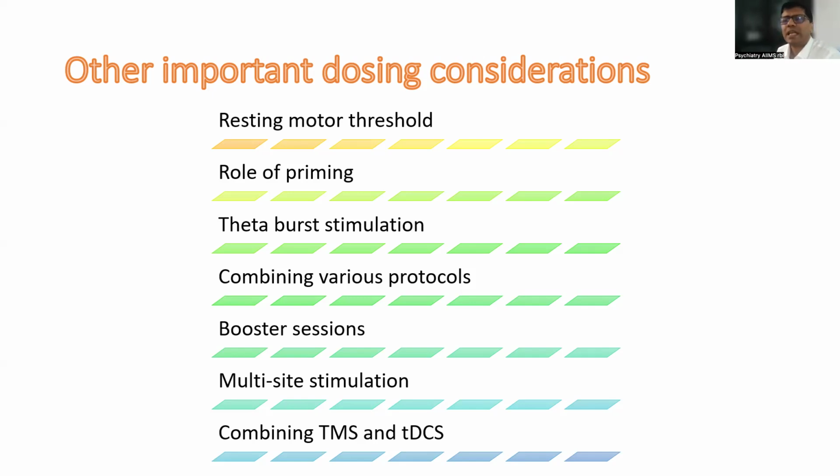Suppose you are treating tinnitus, you can do a multi-site stimulation with sequential different protocols. Suppose you are treating Parkinson disease, you can do multi-site stimulation. So there are various conditions where you can combine protocols and use them in a given session.